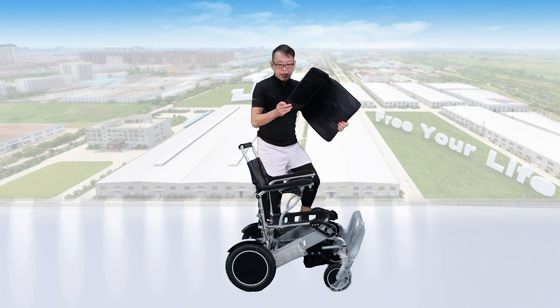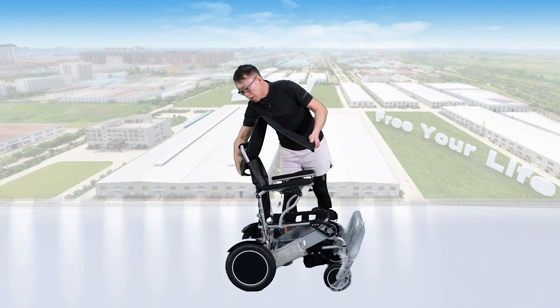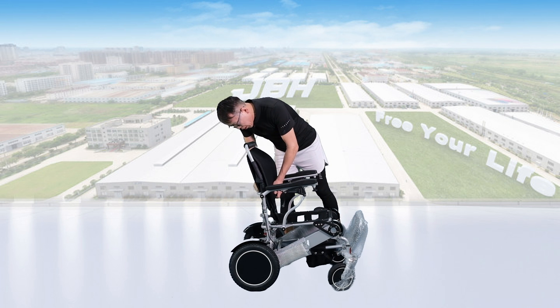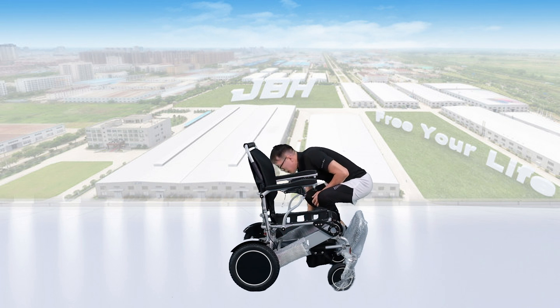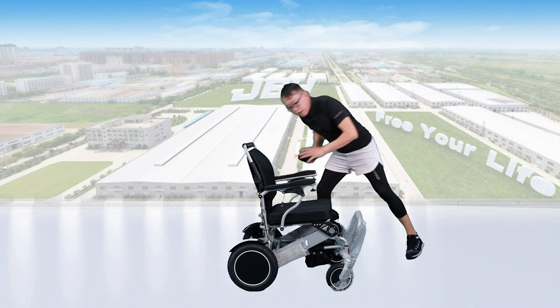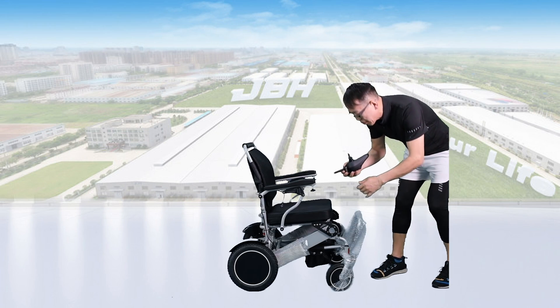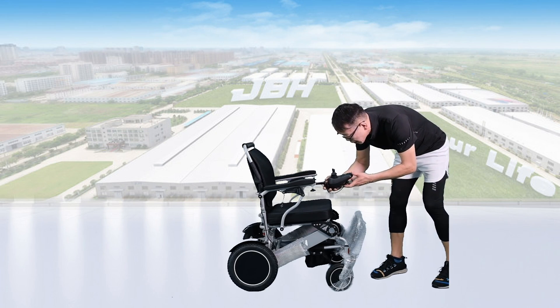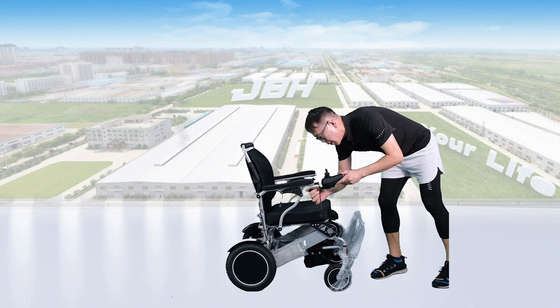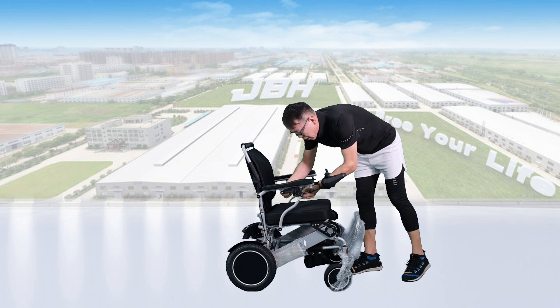Then we set up the seat back cushion here, logo to the back, and a seat cushion on the top of the seat. Slide in the controller pipe through the frame here, under the armrest, then tighten the knob and connect the wire.